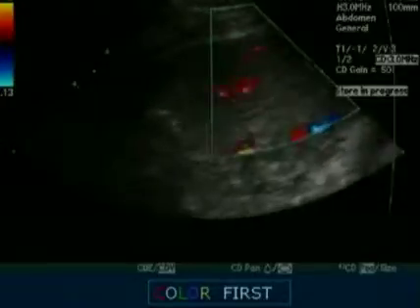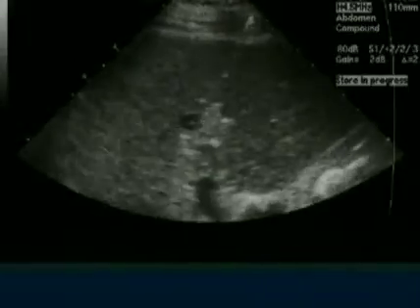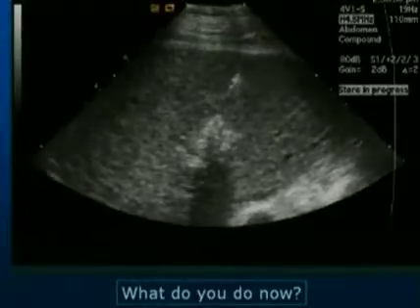You can see the slightly hypoechoic lesion. Here's the needle as we place it, the fairly echogenic needle, and you can see the more hypoechoic lesion. And then this is as we do the RFA, you can see the needle becomes very echogenic at the site in which I place the needle all the way through the lesion to do the RFA. Now I start my pullback, and during my pullback I'll also cauterize the tract to prevent any potential bleeding.